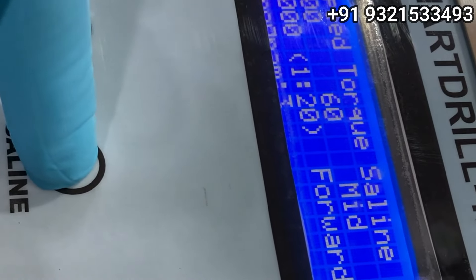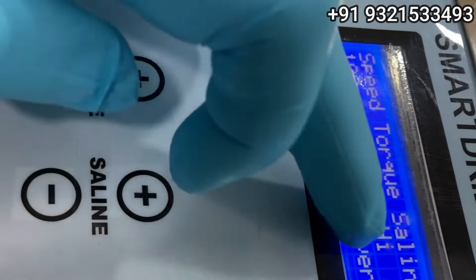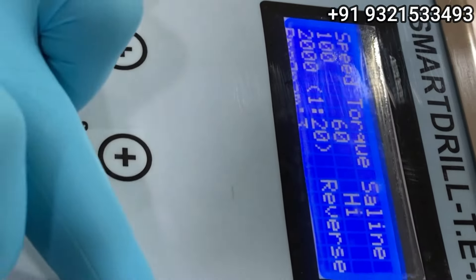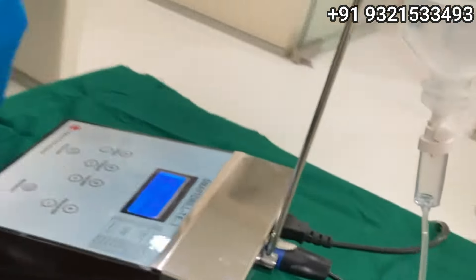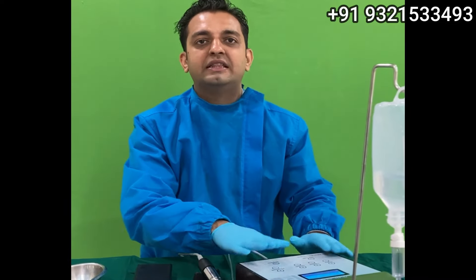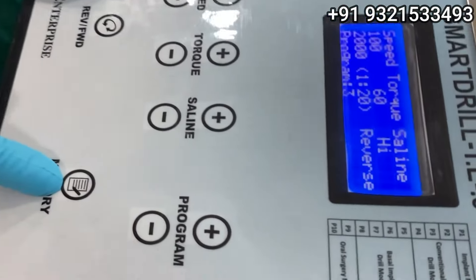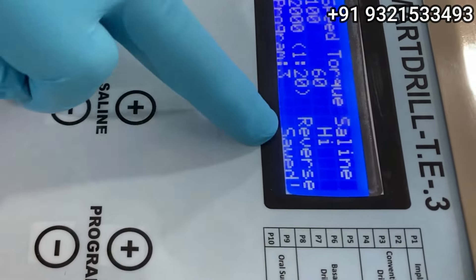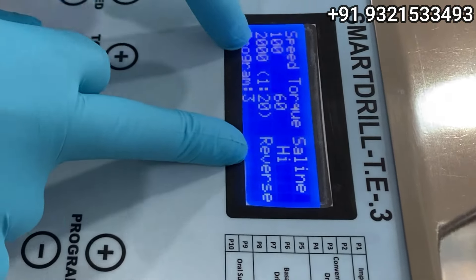You can turn the saline on or off, or set low, mid, or high irrigation settings. You can spin in forward as well as reverse mode. All these programs are preset, but if you want your own customization, you can save 10 custom programs in memory. I press the memory button and you can see it says 'Save' — you can save your own speed and torque settings as required.